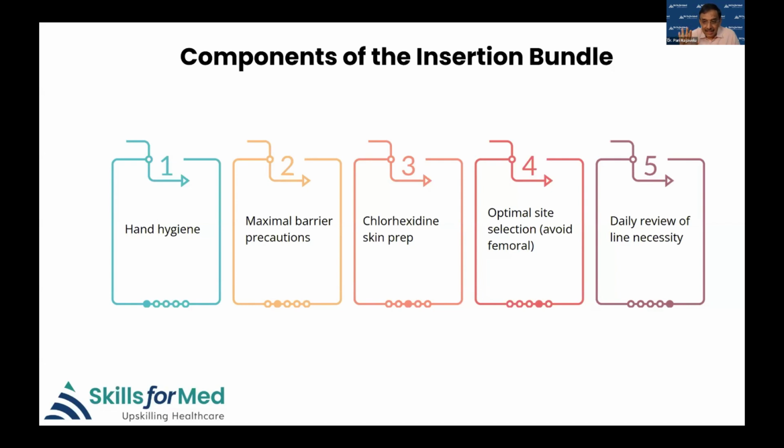As Stella pointed out, even though the central line is done at the bedside, you are actually going through the skin into one of the central veins. So it becomes a very critical procedure, and you need to follow all the sterile precautions which are followed in the theater.